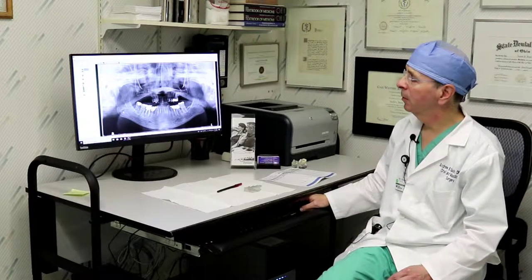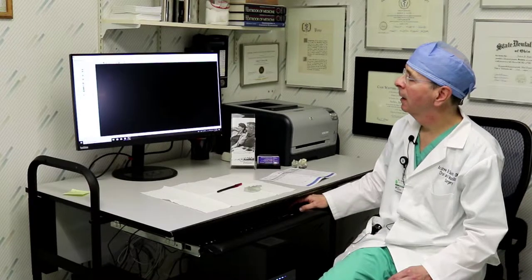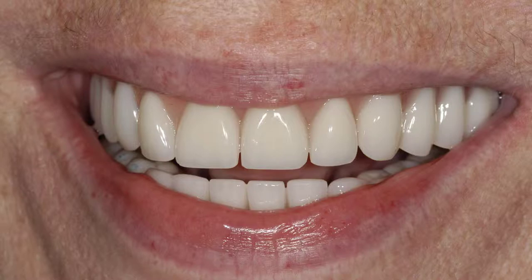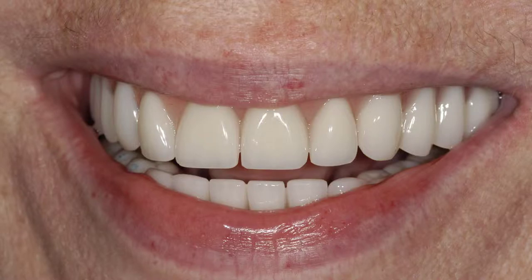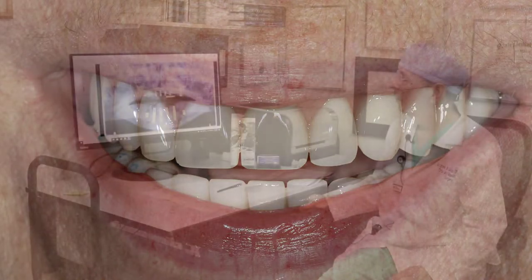We took the patient to the operating room, took out all of the teeth, put in the implants, did the bone grafting, and this is the end result. We went from old rotten teeth that weren't serviceable to brand new implants supporting brand new teeth the following day.